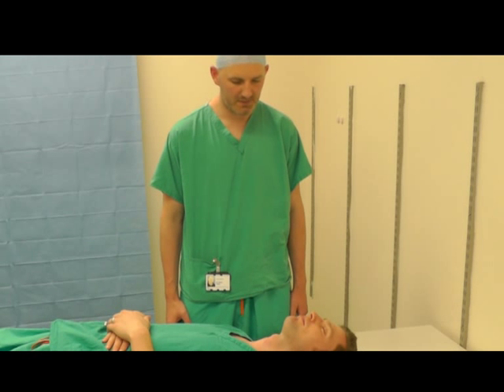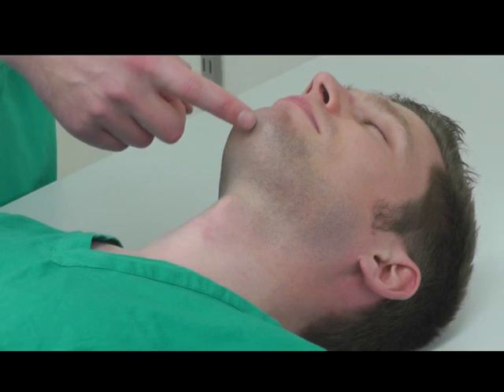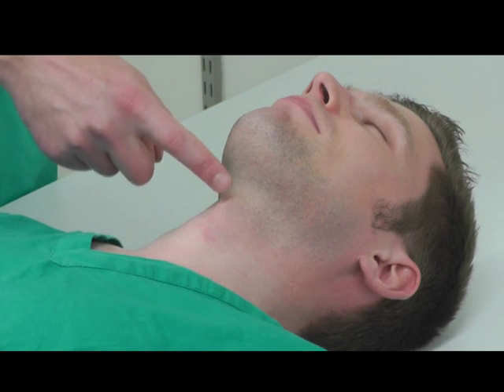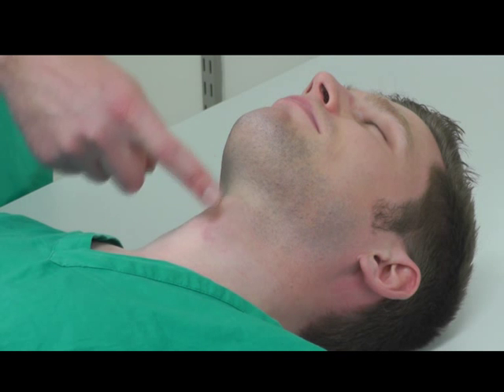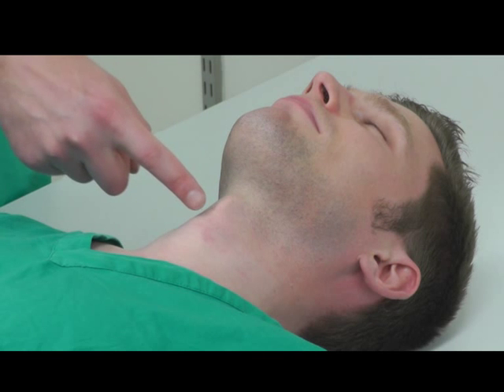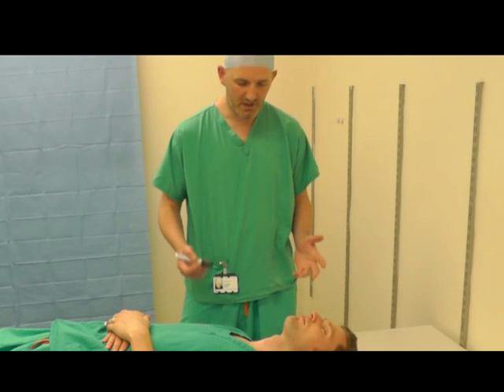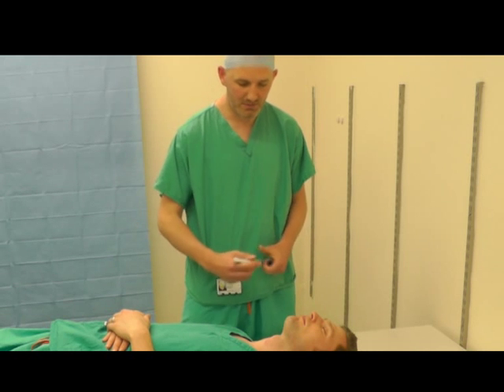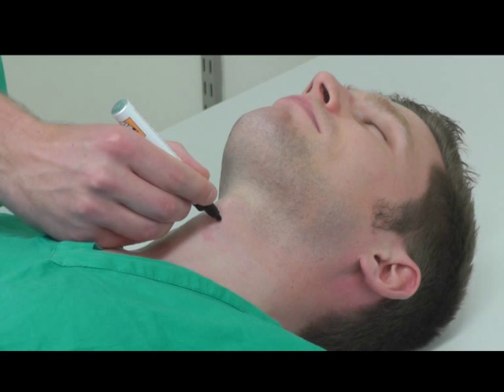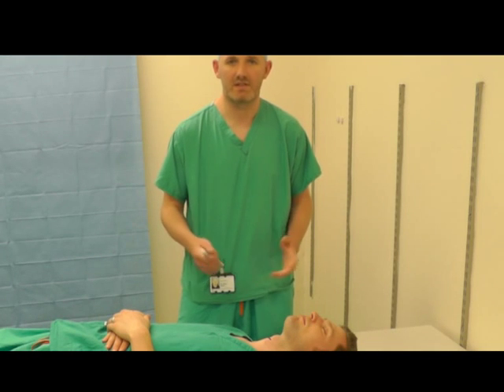So let's look at the anatomy. To find the cricothyroid membrane, put your finger on the chin and the midline, move down the neck. The first structure you'll find is thyroid cartilage, and the second structure will be the cricoid ring. In between the two is the cricothyroid membrane. In a trauma scenario, or if you're really worried, then you should be marking this prior to induction of anaesthesia. Because in a can't intubate, can't ventilate scenario, you'll be under a loss of pressure.